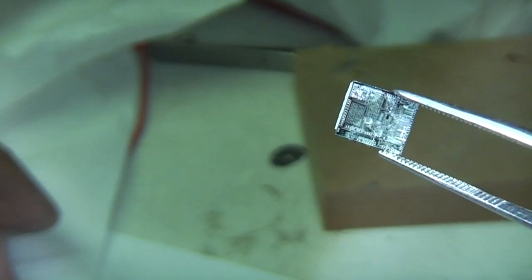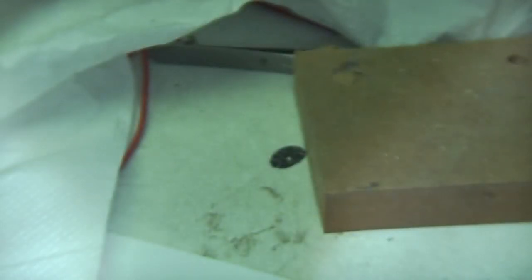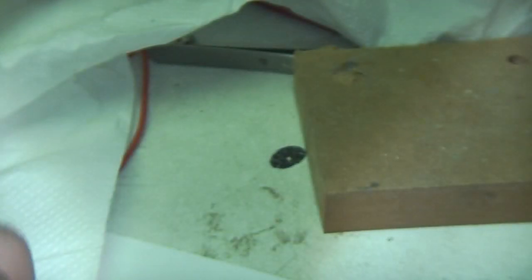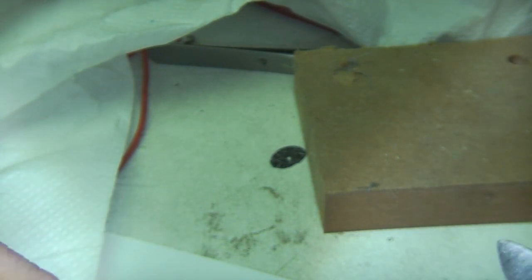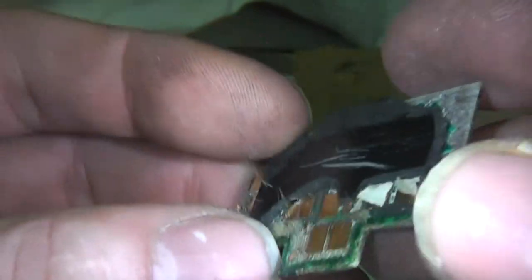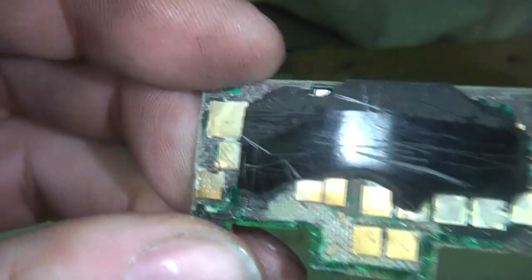We see that this is that big chip. There's quite a lot on it, so we'll try and get a close look at that under the microscope. And there's just a few of the fragments where the epoxy's come off and taken the chip off. None of these chips seem to be packaged to any significant degree. They all seem to be pretty much bare die onto the board, and so I'm not totally sure if they're sort of bump pads on the die onto the PCB or whether they've got bond wires, or maybe there's some combination of the two. So we'll take a close look at those, and then also I'll see if I can crack a little bit more off this, but I suspect it might take a bit more chemical attack before this comes right off.